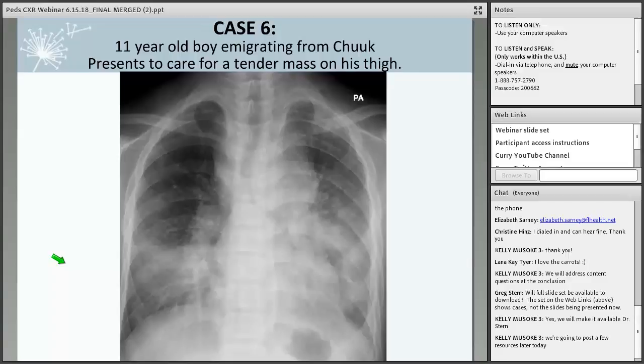The next thing I want to comment on is the fact that Dr. Vu showed you some beautiful CT scans, and we have a few CT scans in the cases that I'll show you. But in case you don't know, CT scans are rarely necessary for the diagnosis of pediatric tuberculosis. The times that I wind up obtaining CT scans are usually when there is something else in the differential diagnosis. Sometimes it's an immunocompromised host, and I'm asking the question, do they have a fungal infection or a malignancy? Typically we do not obtain CT scans.